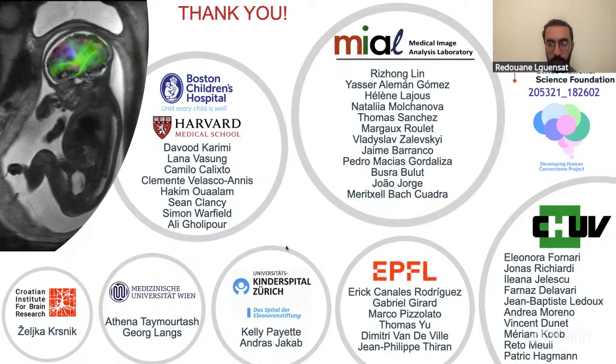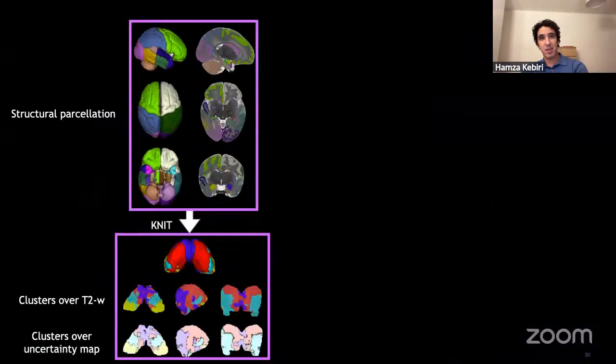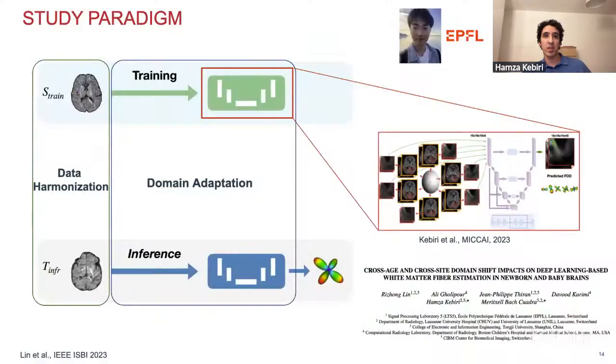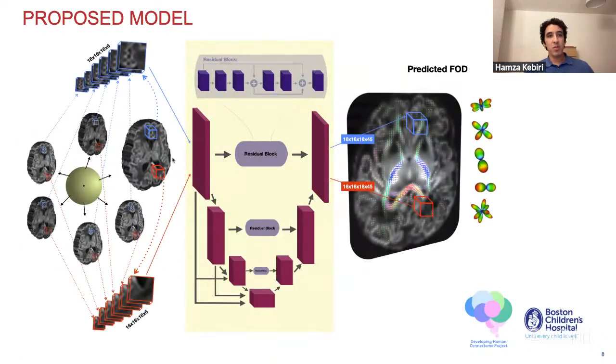Okay, thank you. Next question is about the UNet you used in your first project. Again, a direct question: is this a 3D UNet and what was the loss function used? Yeah, so it's a 3D UNet. We basically used patches of 3D shape, and we just used the mean square error, so it was working quite well.